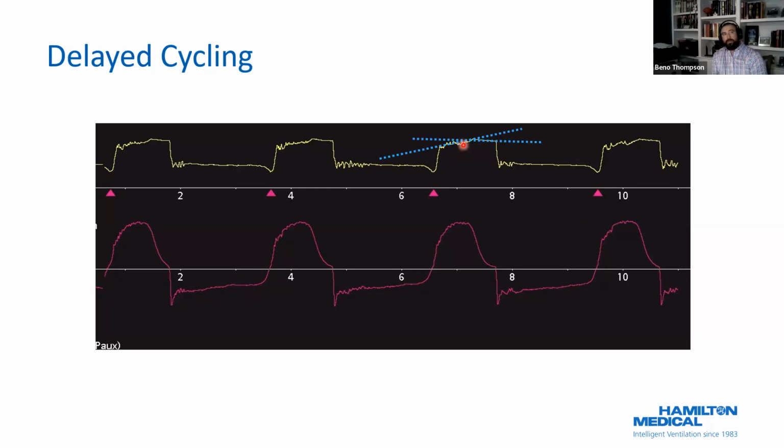You can also do it with the flow, across the patient-initiated portion, and then down where the ventilator actually starts to cycle. If you draw a line through them, they'll intersect at the exact same point on both waveforms, right? So this patient actually needs this for an I time, not the rest of that.